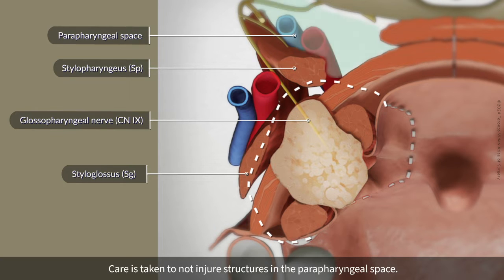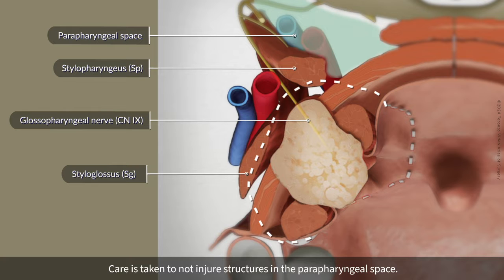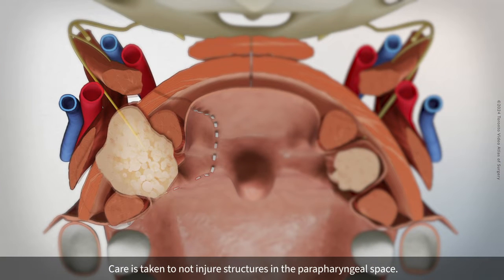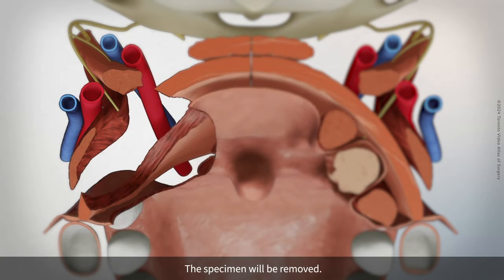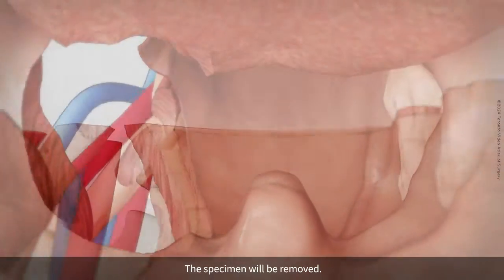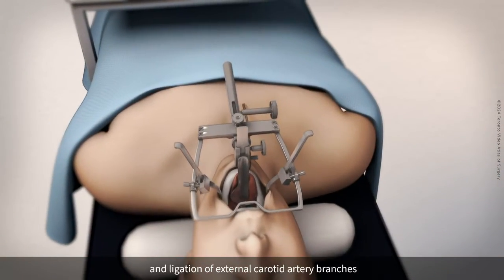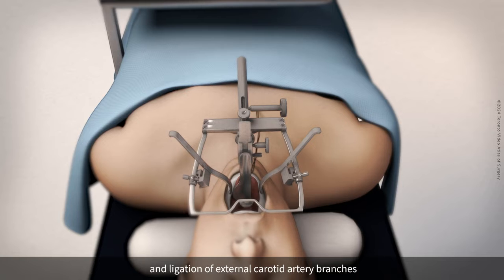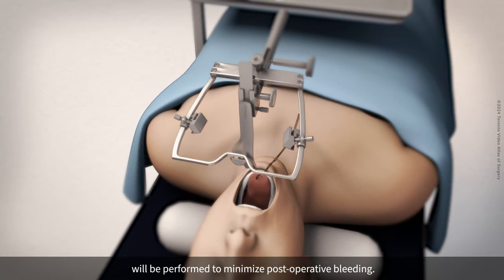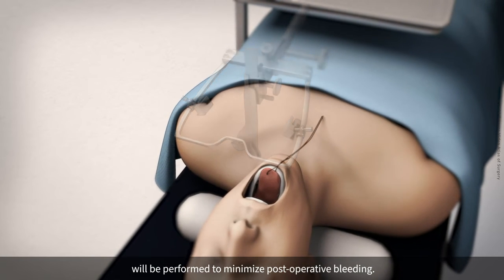Care is taken to not injure structures in the parapharyngeal space. The specimen will be removed. Routine neck dissection and ligation of external carotid artery branches will be performed to minimize post-operative bleeding.